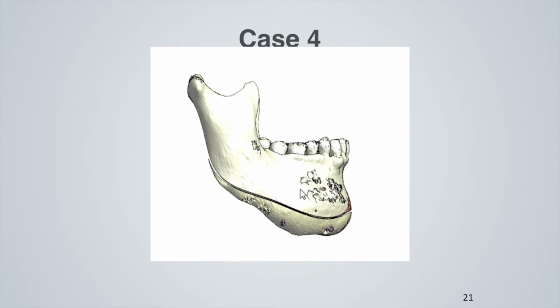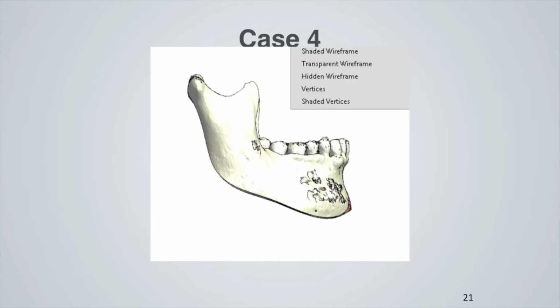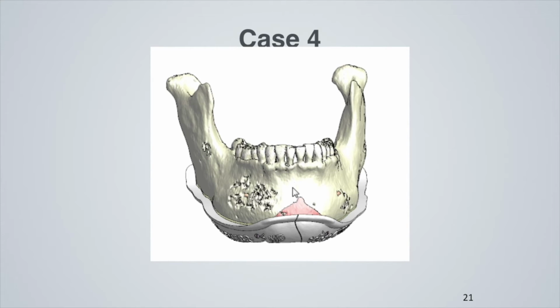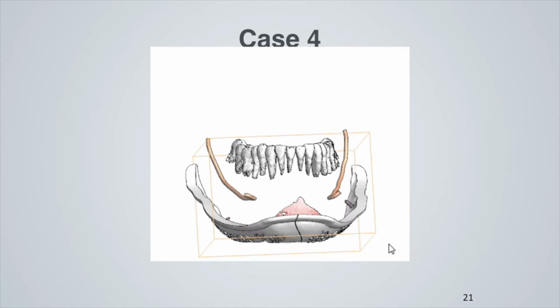So that's the right orbital floor fracture reconstruction. And a short video to show that this is the abnormal looking mandible. I'm sure many of you will agree with me that we can do the simulation of the surgery, the computerized technique, to exactly delineate the area that we want to remove, and to make sure that we get it right, as we cannot afford for our patient to have the asymmetry as well as the injury to the nearby vital structures such as the nerve as well as the teeth.